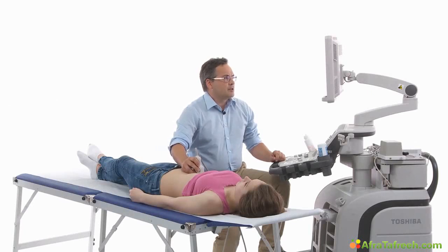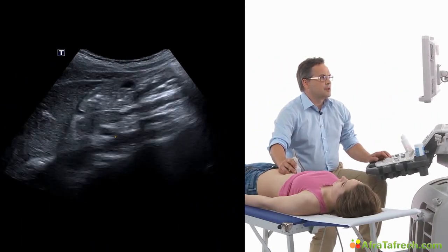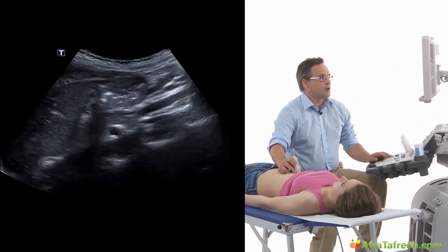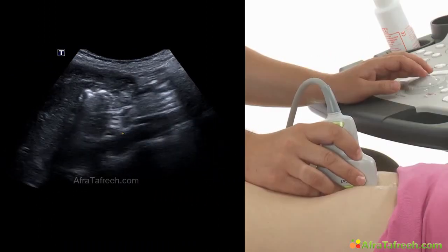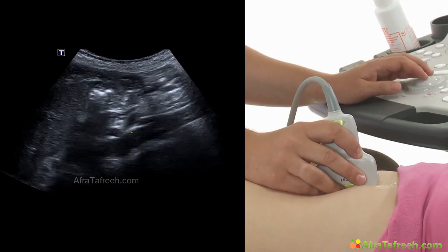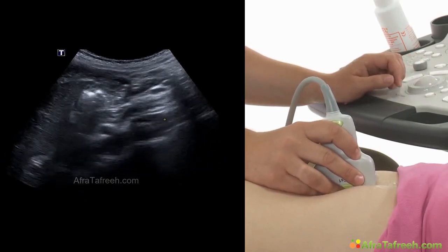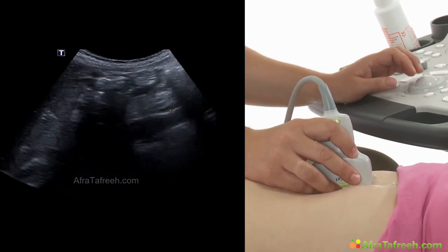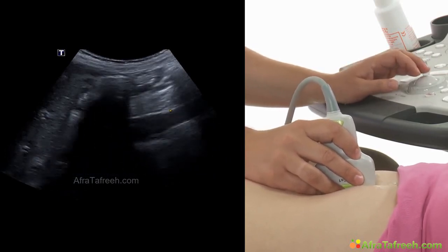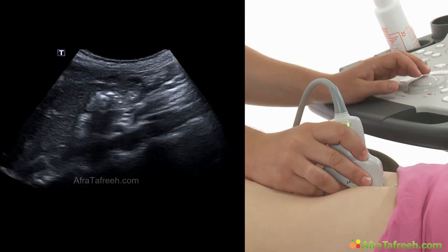When we scan the aorta, we can easily see a very strong and bright hyperechoic wall of this vessel. And this single pulse movement over here.